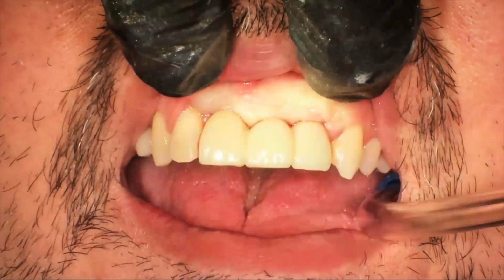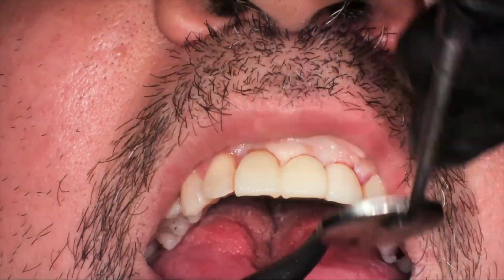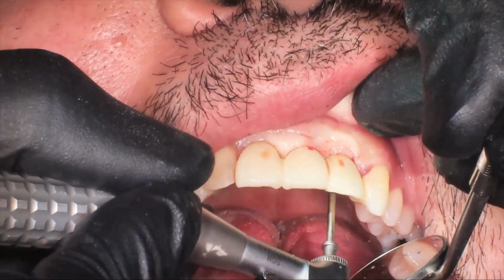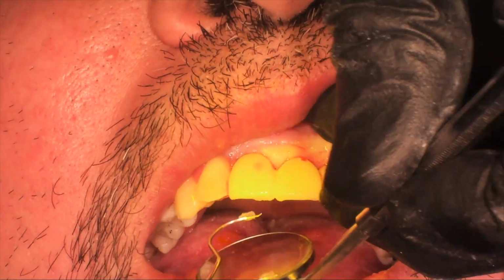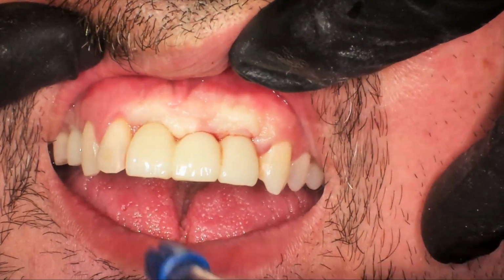And then we're going to clean out the lingual access area to make sure all the blood and stuff is out, and then we're going to stuff that area with Teflon tape, followed by, in this particular case, some Tempit clear light cured temporary material. And now our patient's going to leave with this temporary bridge in place to allow the tissue to heal, and then we'll have the patient come back and take our final impression.